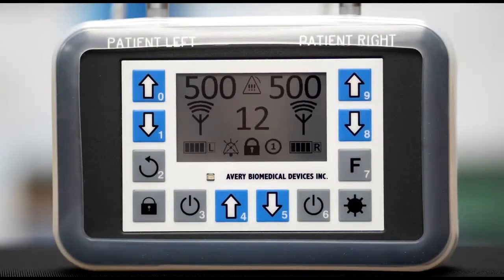Welcome to the Spirit Transmitter instructional video. All controls of the Spirit are done via an easy-to-use display and keypad. Adjustment of the external controls is performed on an individual basis by the physician, caregiver, or patient as necessary. The Spirit is fully compatible with existing patient implants and antennas.